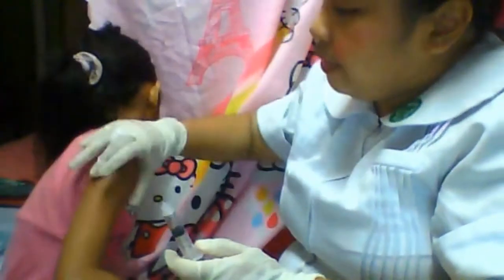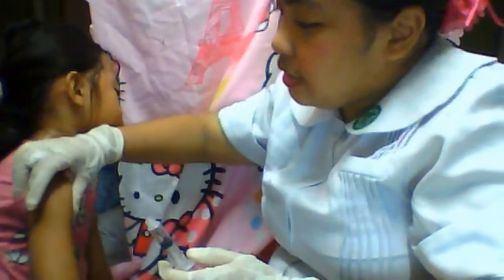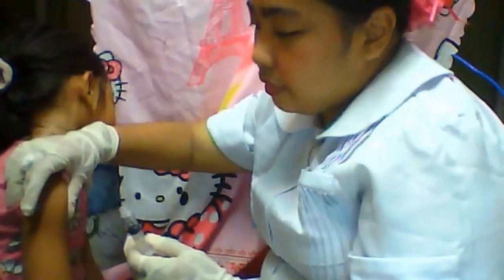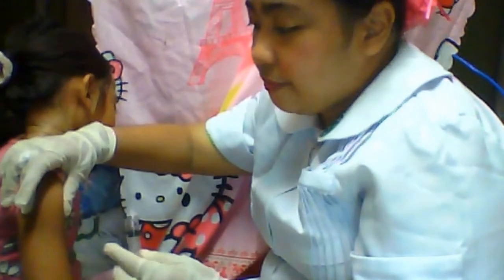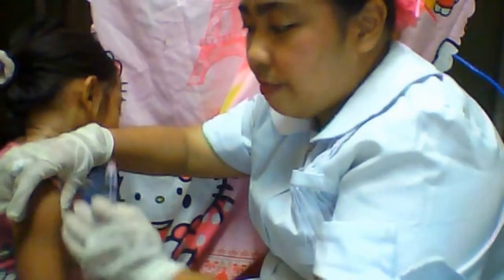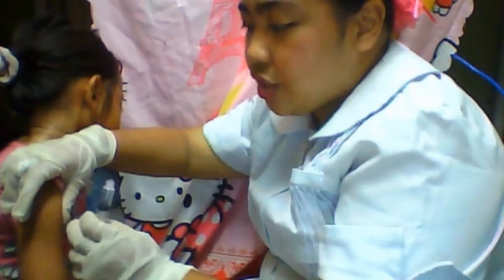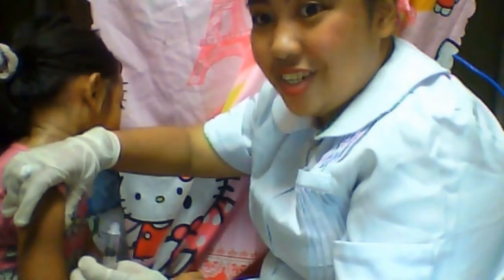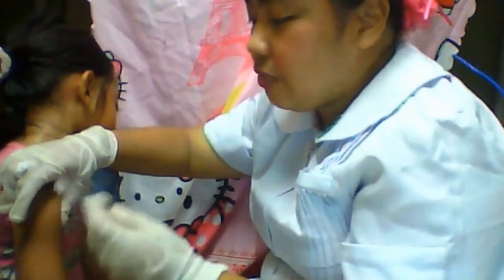So again, we'll do it like this. Okay, you pinch like that to give you better access to the muscular area, and pinching would actually sort of lock the medication once you introduce it.